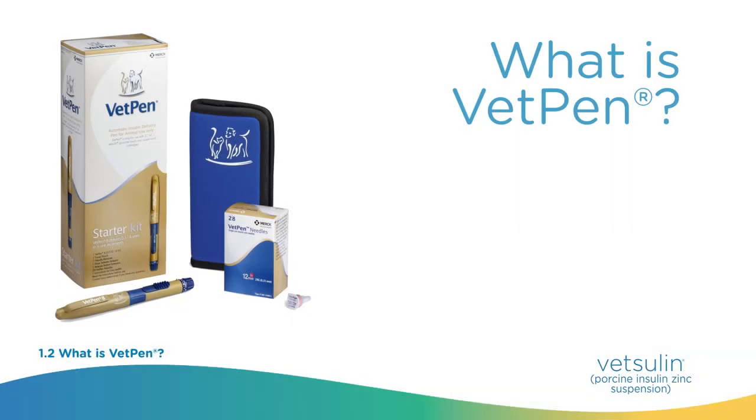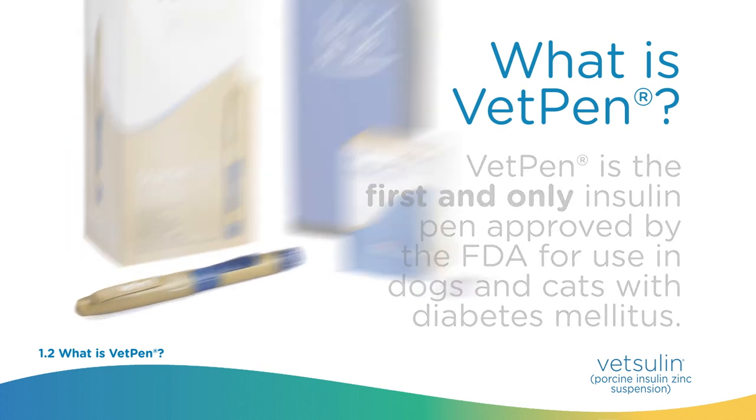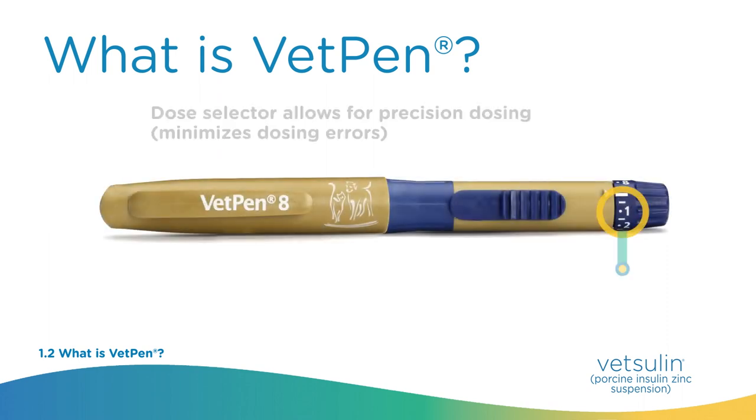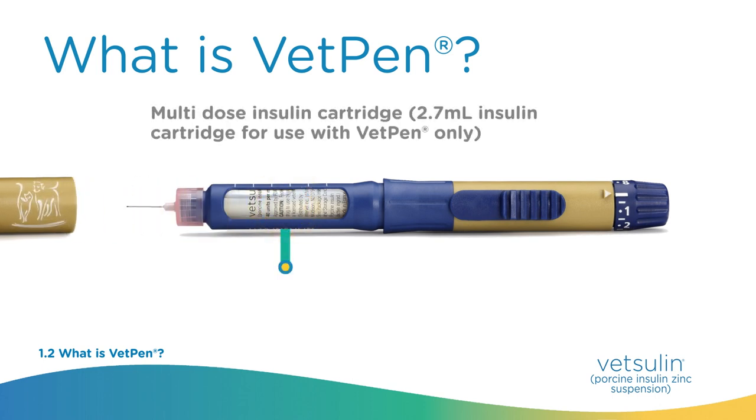VetPen is the first and only insulin pen approved by the FDA for use in dogs and cats with diabetes mellitus. The VetPen is ergonomically designed for easy handling and dosing. Additional adapters are provided to further assist pet owners with visual or manual dexterity issues. The dose selector allows for precise dosing and minimizes dosing errors. It is used with a multi-dose insulin cartridge.